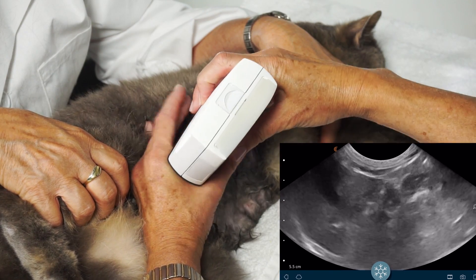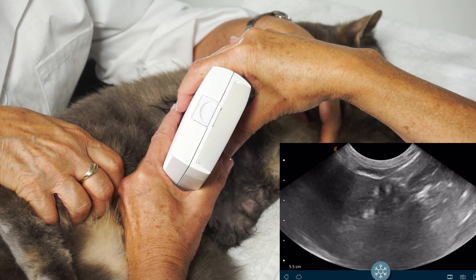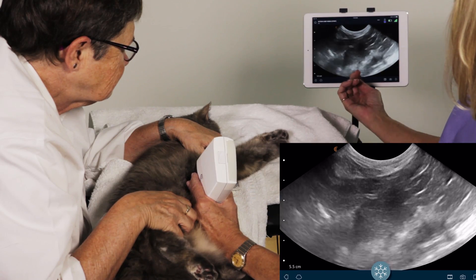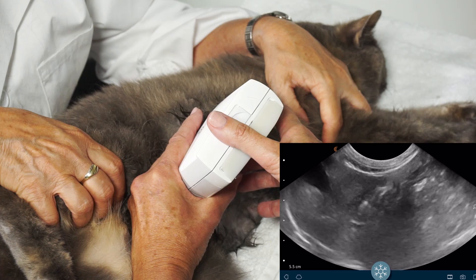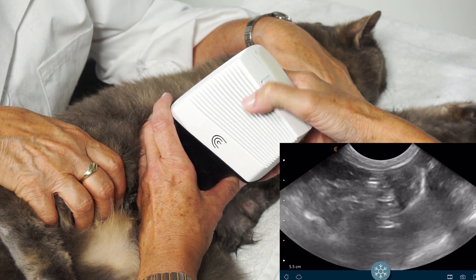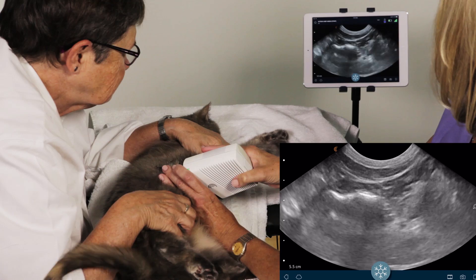I'm just going to move that more into the picture. We're going to scan all the way through, all the way back, all the way up to the end. Then we're going to go in transverse, so we're going to turn the probe towards her right and scan her liver.